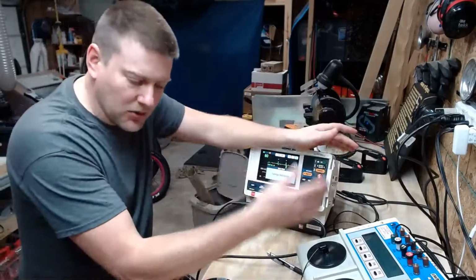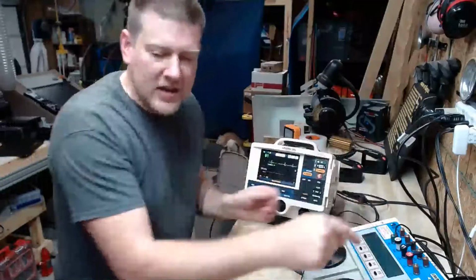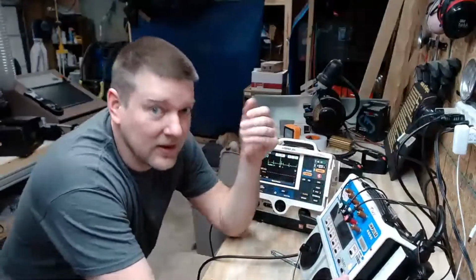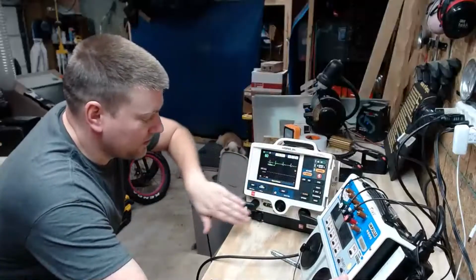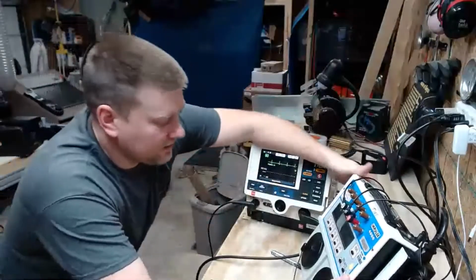So you press and hold, and when it senses the next peak, that's when it discharges. And over here on my analyzer, it tells me some very important information. One of them, the most important, is the amount of milliseconds between the sense and the discharge. And on this one, it's 24 milliseconds on this LifePak right here.